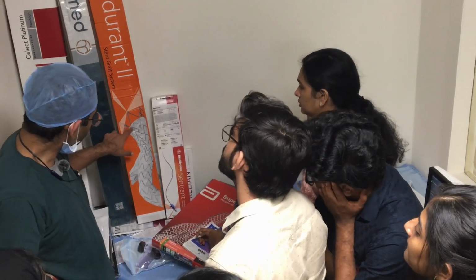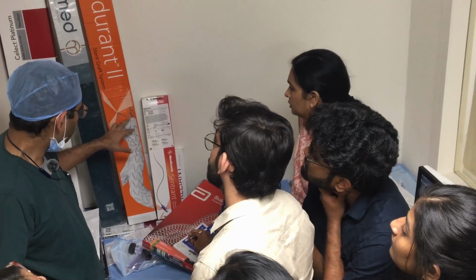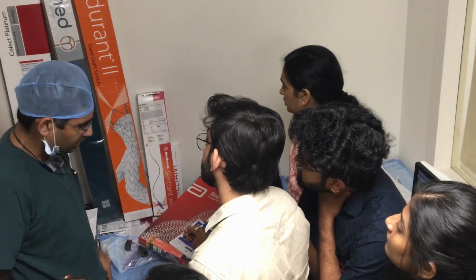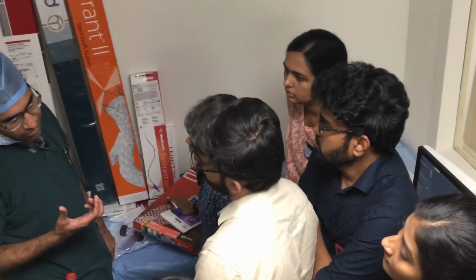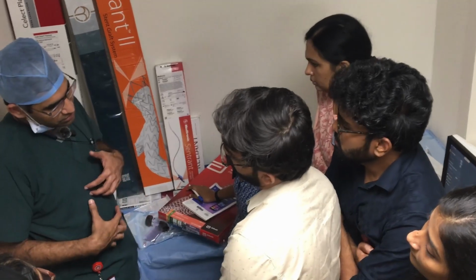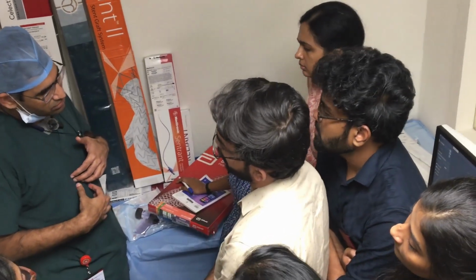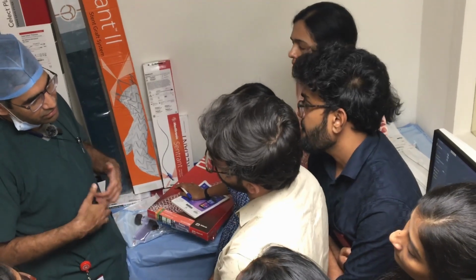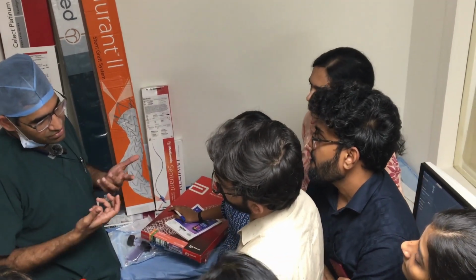This has hooks also on top, so it is used for fixing. In large vessels, one of the major problems is that over time there is aneurysm growth and the device migrates downwards. So after you deploy in a large aneurysm, 2 or 3 years later the device will be in the aneurysm. It will still be filling.